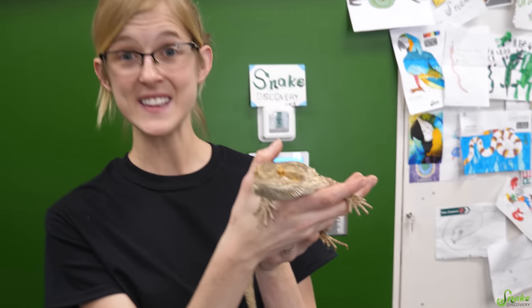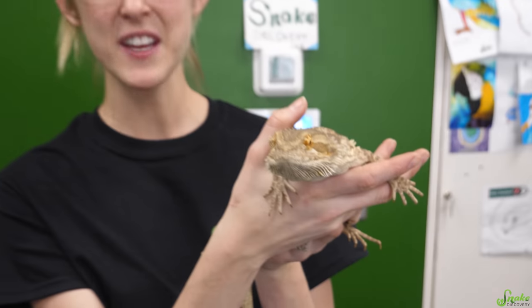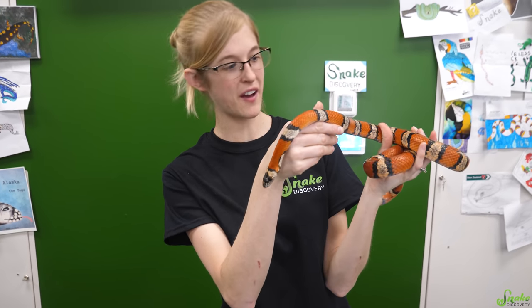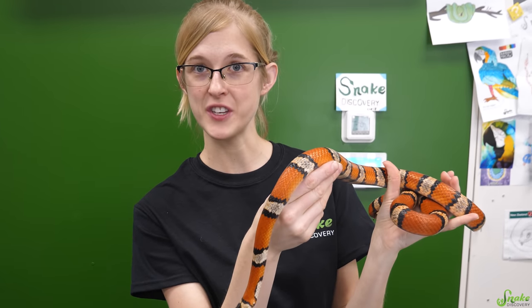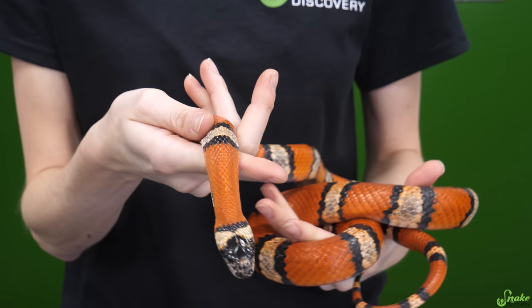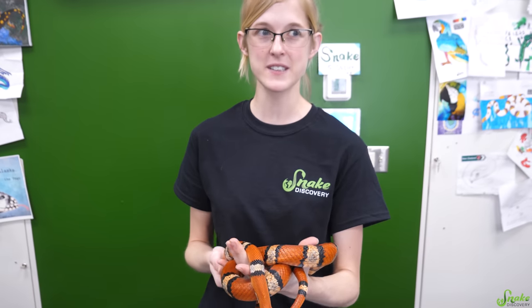Now that we've gone over how to give lizards injections, let's talk about how to give snakes one. This is Tutti Frutti, our variable king snake. She's an old gal, she's close to 20 now. They also mistook her for a milk snake for most of her life — we used to think she was a Mexican milk snake, but turns out she's just a variable king. So we're going to use her to show you how to do an injection for a snake.